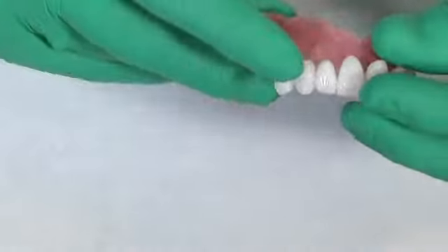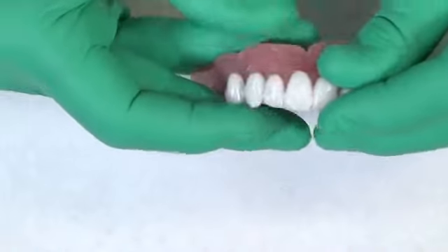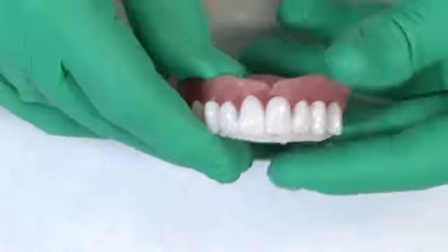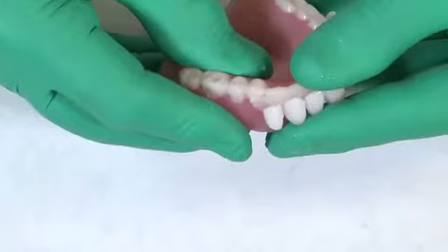This makes the shells fully moldable when you place them on the thin wax. Position the shells over the thin white wax and position the incisal edges in line with the occlusal plane. You can easily adjust the position of the teeth and even rotate individual teeth to make a natural tooth arrangement.